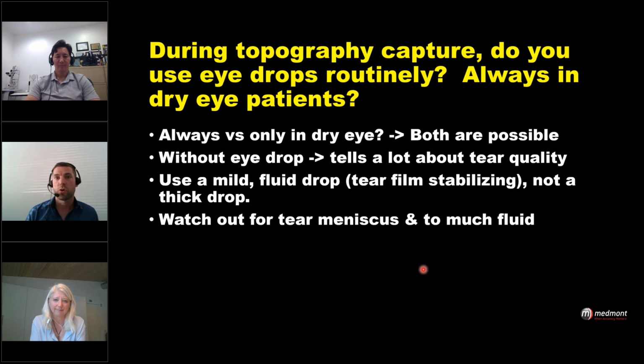But I know there are people who are always using eye drops. I don't know, Mette, you? Mette, please, your perspective. Yeah, I agree very much with Nikki. I do the same thing. I always start the capture without the eye drops, and then I use eye drops if needed, but only if the outcome of the topography without the eye drops is not sufficient.